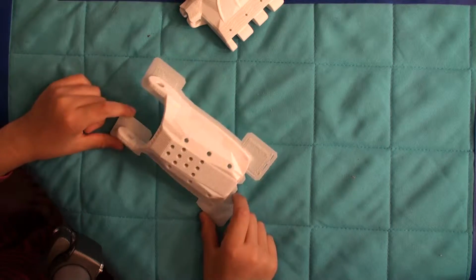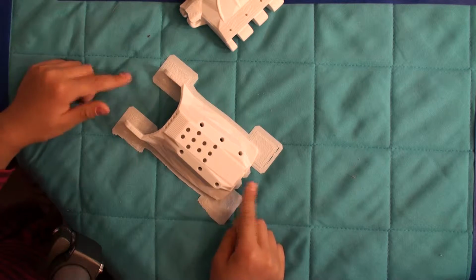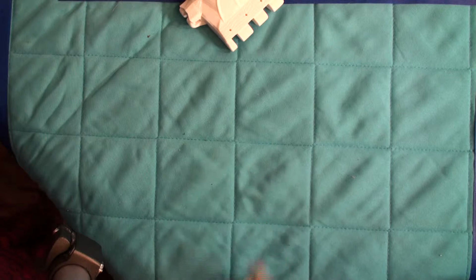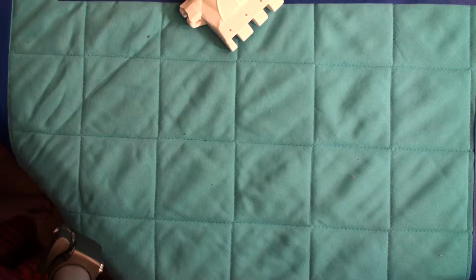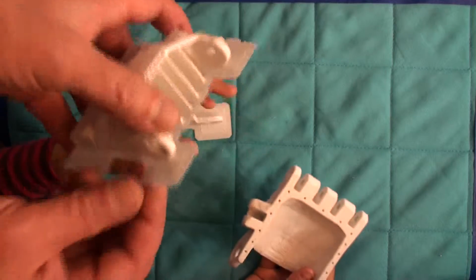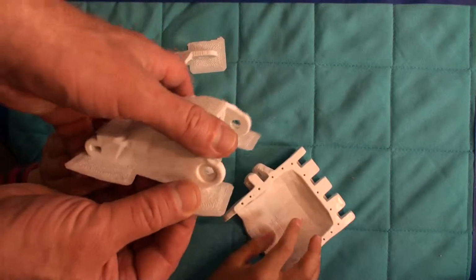This is just like the decorations, what we peel off. They're to help it stick down to the bed. But they break off pretty easily. I'll break some off right here.